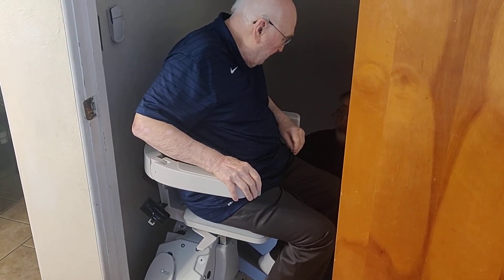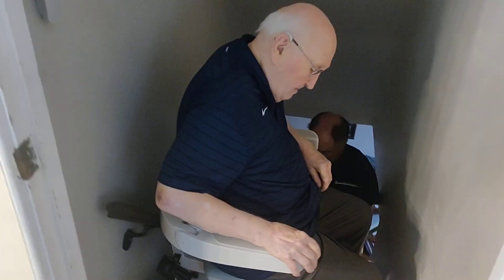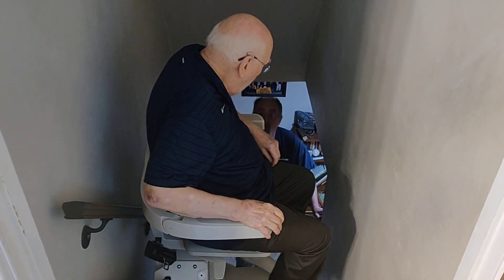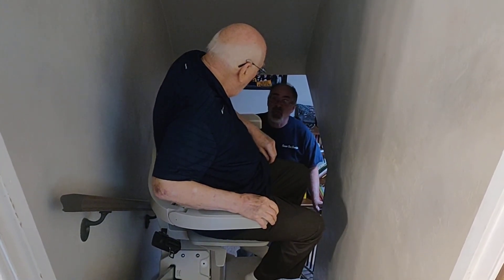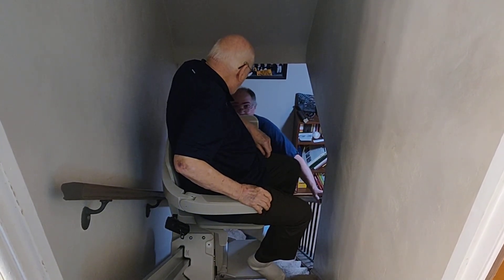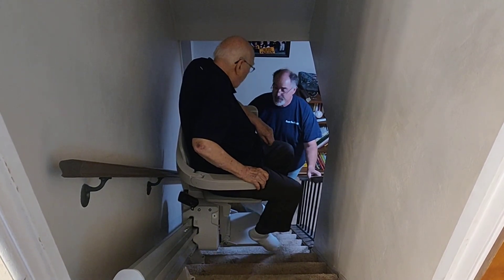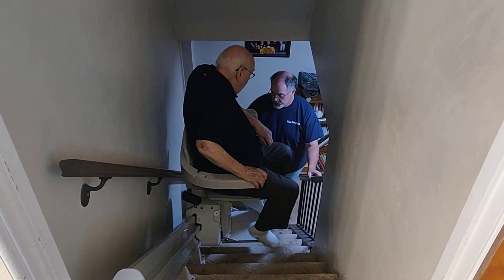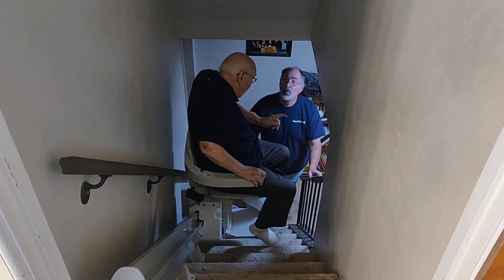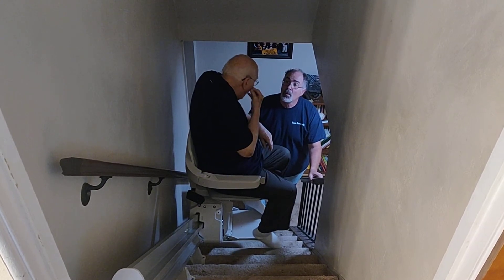Okay, so come on down. I'll get out of your way. Now this is going to stop before you get to the bottom because we've got this rail here you're going to put down. And that room there is my bedroom, so I'll be using it as much, if not more, than others.